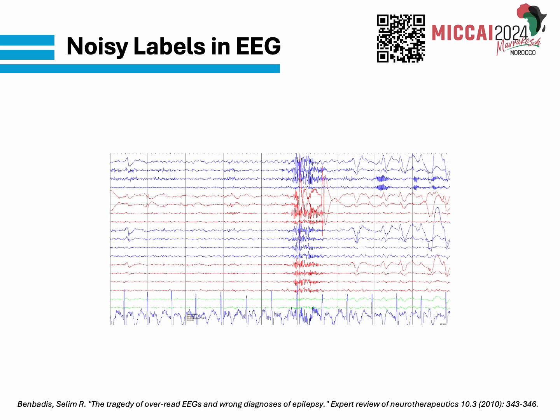EEG is a high-dimensional temporal signal collected from multiple positions on the brain scalp. EEG is typically the first modality used to monitor epileptic patients, with recordings lasting several hours. Following this, trained experts manually go through such long recordings to localize seizures and create epileptic seizure datasets.